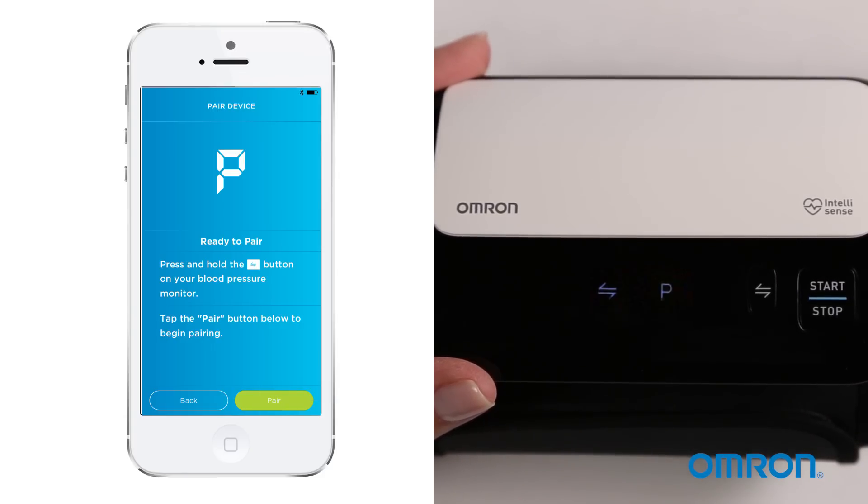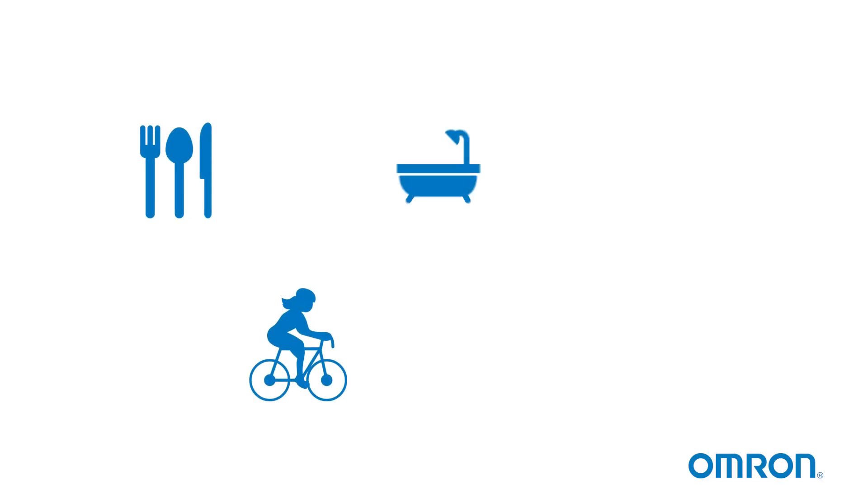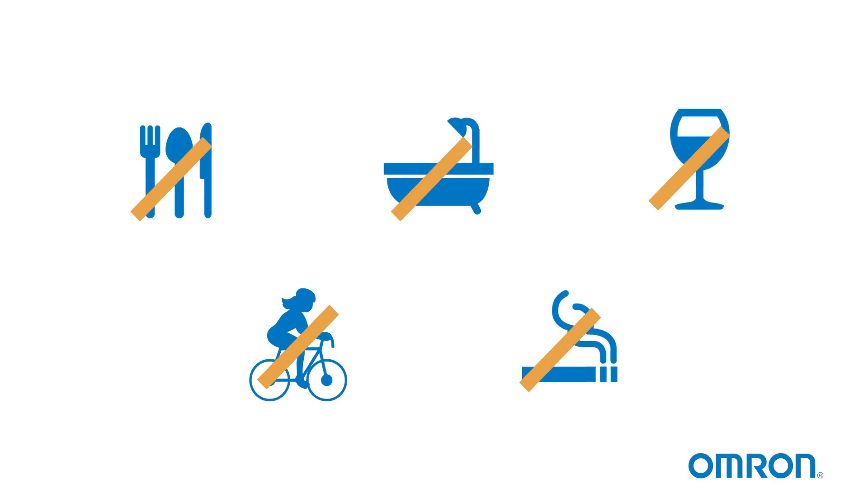To make sure it's as accurate as it can be, here are a few tips. Do not take a measurement within 30 minutes of eating, exercising, bathing, smoking, or drinking alcohol.